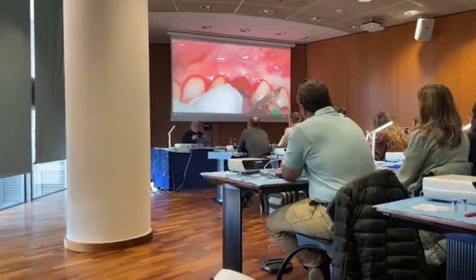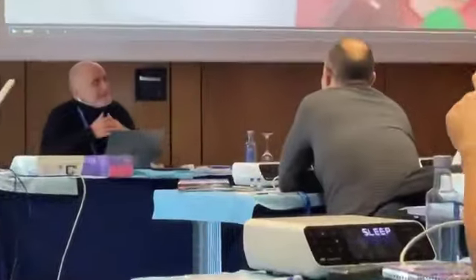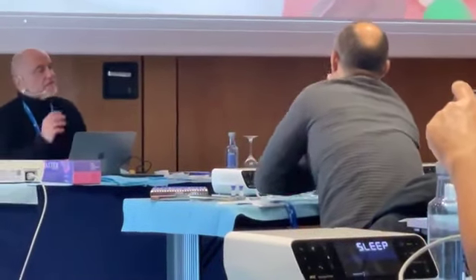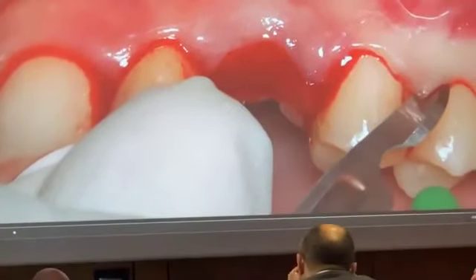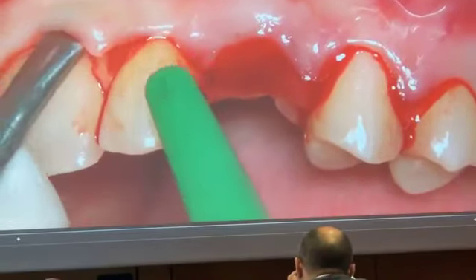the buccal. And so you have even more to compensate to make the papilla grow. So it's completely wrong to make a mid-crestal incision, but this is the mucogingival approach because we are elevating a flap that is exactly the same flap that we are elevating when we treat gingival recession.